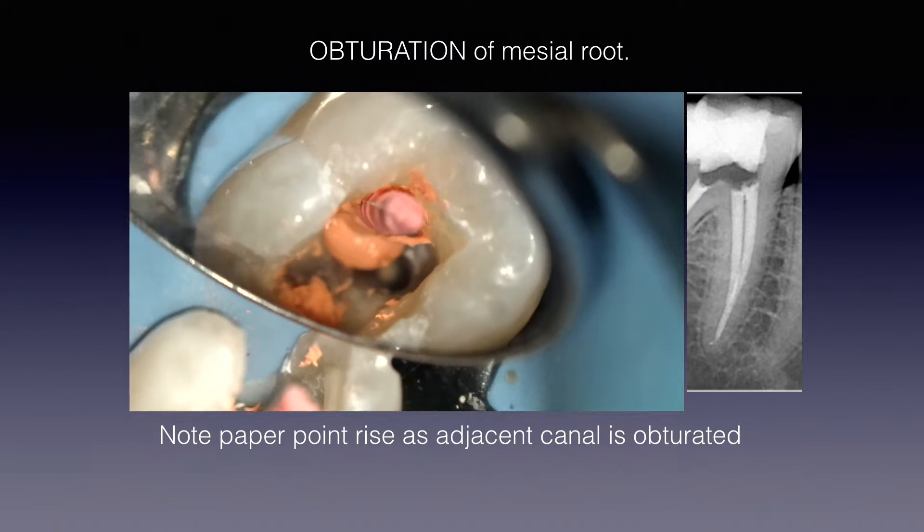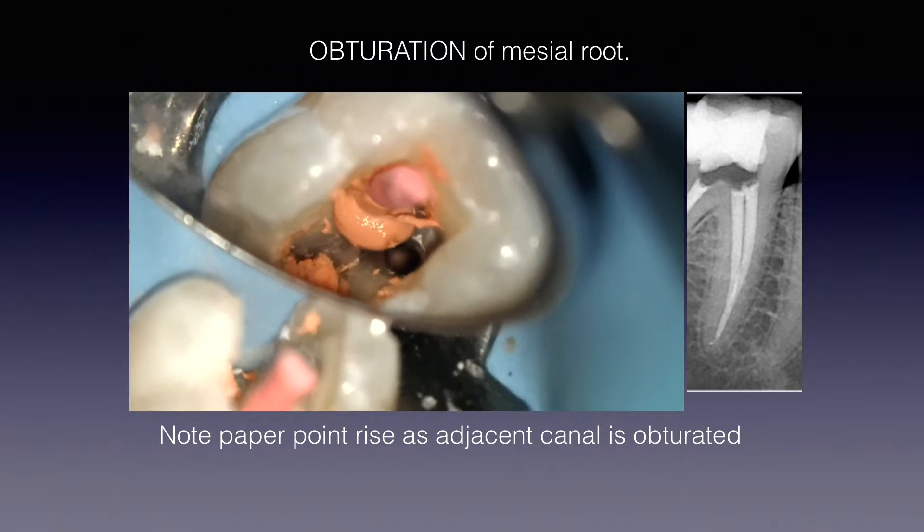Notice as I'm zooming in with the microscope into that unobturated canal, you can actually look inside — you see that little white area? That's the obturation already filling the second canal. Imagine both canals are 20 millimeters in length individually. We've obturated one to 20 millimeters and it's backfilled the other to about 5 millimeters or so. Now I'm worried — if I put my gutta core to 20 millimeters, am I going to extrude stuff out the apex? One of the beauties of this system is that will not happen. Because that second canal is partially filled, instead of being 20 millimeters long, let's say it's now 15 millimeters. As you obturate with gutta core — which is all gutta percha, all warm — once it meets resistance apically, it flows coronally.